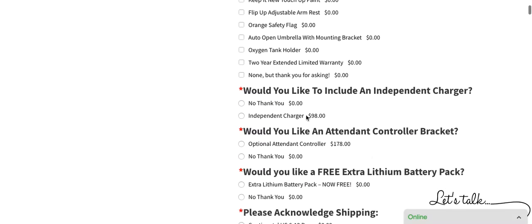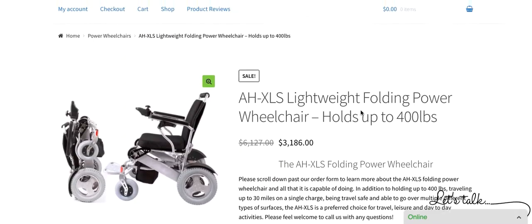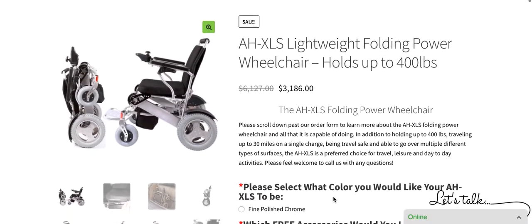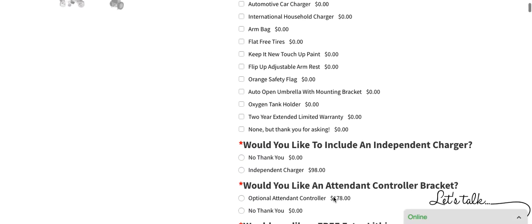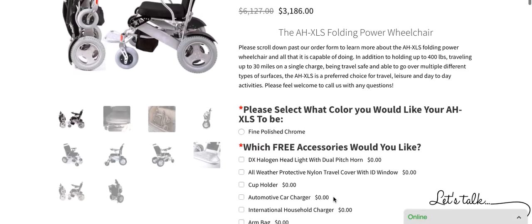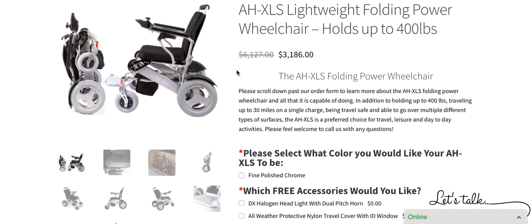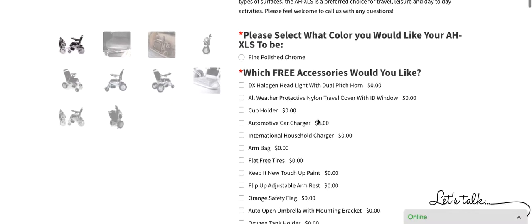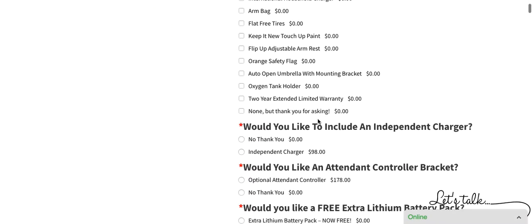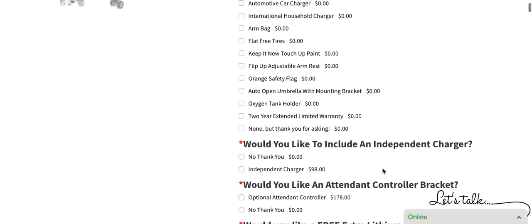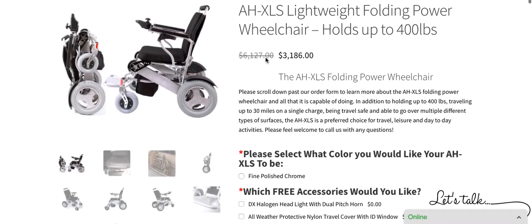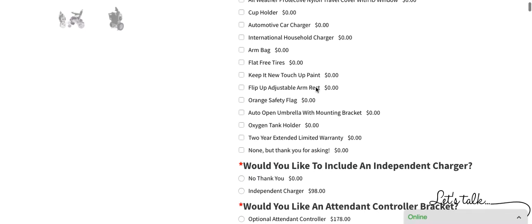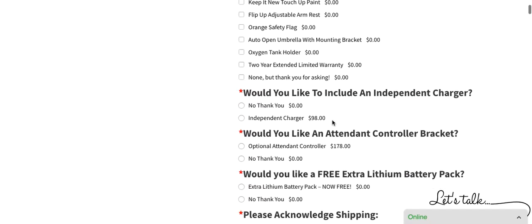We do have the independent charger available that would simply be if you wanted to charge the batteries outside of the chair where the chair was not present and you took the batteries out and charged them. Otherwise, the charger works in tandem with the joystick and that's how you would charge it. And we do offer the auto attendant controller bracket which would fit right on the back of the chair.